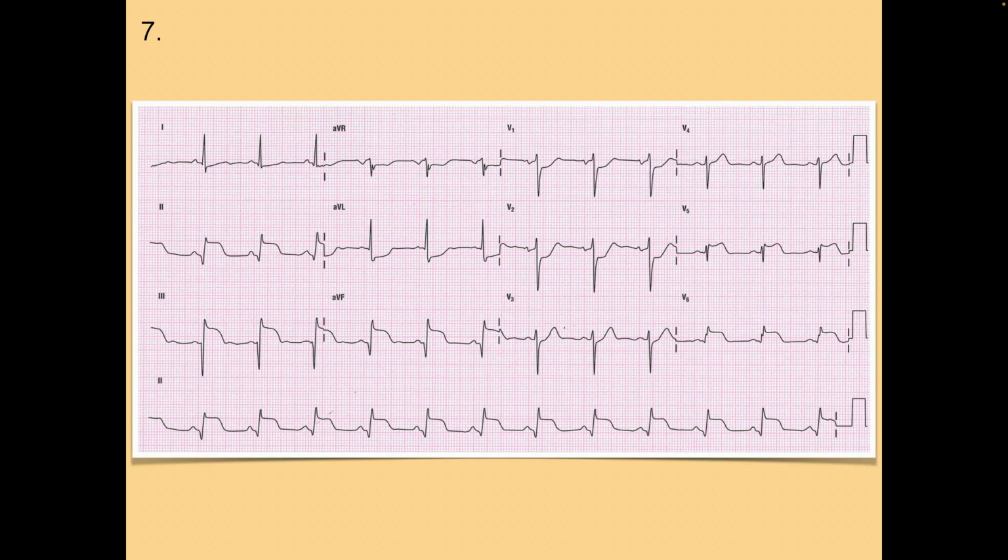When you go through a 12 lead, what I'm having you do is practice, but I'm saying look for a lateral, so of course you go for the lateral leads. That's fine for this exercise, but it's kind of bad technique. So from now on, when you're looking at a 12 lead, the best way to do it is to look at lead 1. Is there elevation or depression? Look at lead 2. Is there elevation or depression? Lead 3.